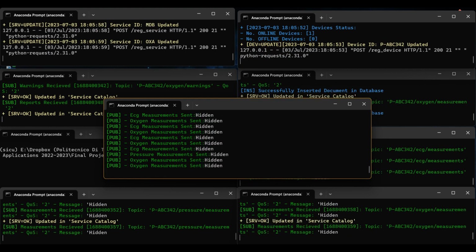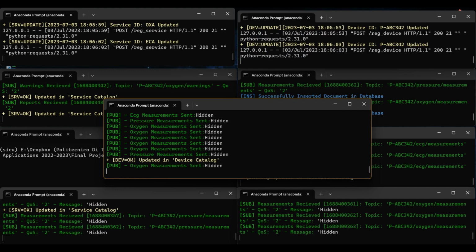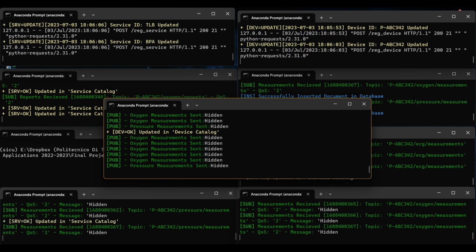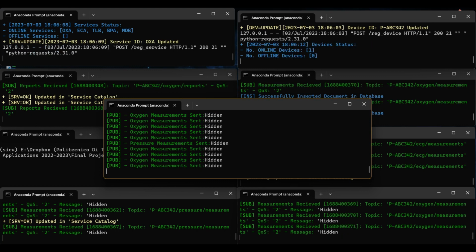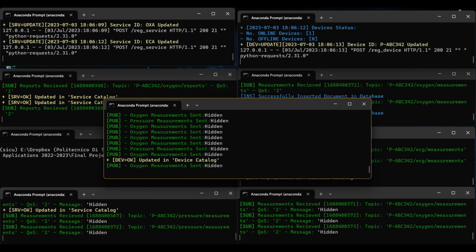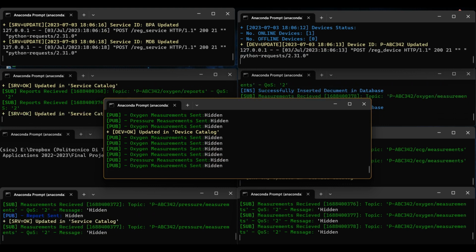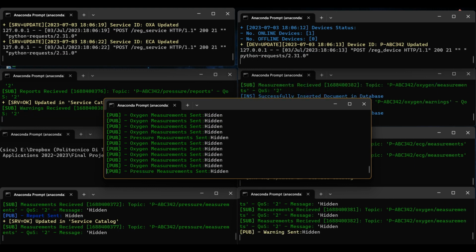I should also mention that each different action, like sending or receiving messages or functions into microservices, is going to be shown in the terminal for logging purposes, but the body of the messages is set to be hidden by default. But if you want to see more details, you can just change these settings later in the settings files.